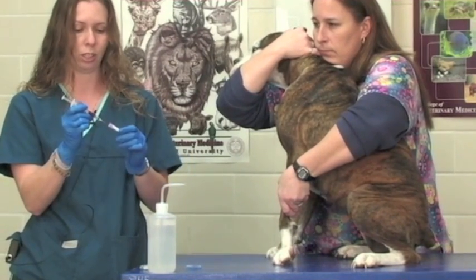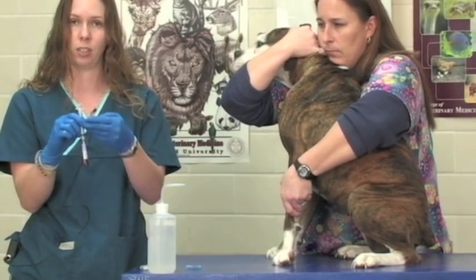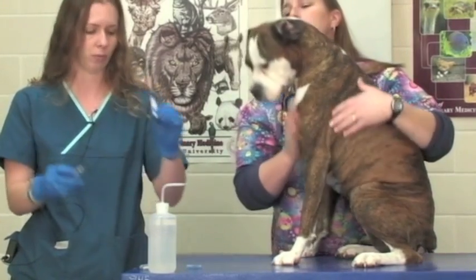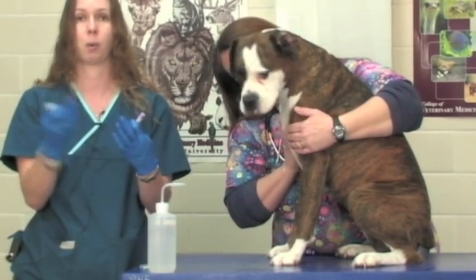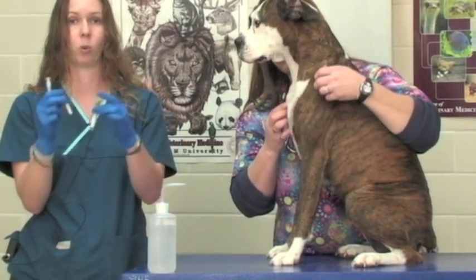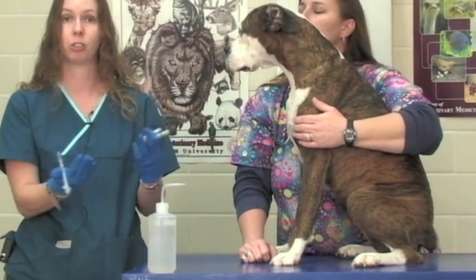After we obtain our blood sample we can gently place the needle into our blood tube. You want to let the suction in the tube drag the blood out of the syringe — you do not want to push the plunger of the syringe to force the blood into the tube. If you do that you may damage the red blood cells in your sample, and if we are running a complete CBC we need to look at the morphology of the cells. Forcing the blood in may alter cell morphology and give a false positive for a disease process. Always treat your blood very gently, and once the blood is in your tube rock it back and forth to mix the sample with the anticoagulant. The procedure is the same for any color tube — just let the suction drag the blood in.